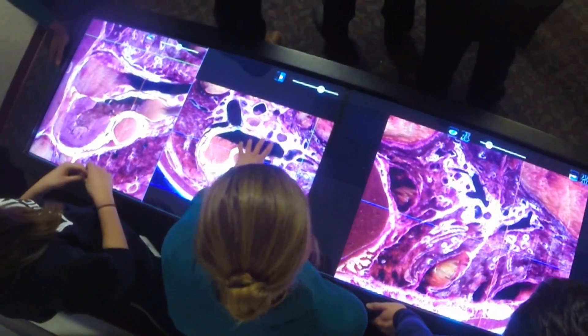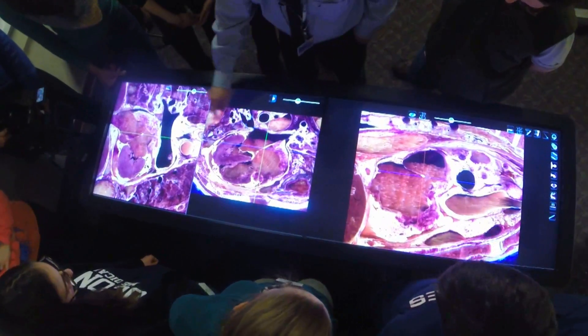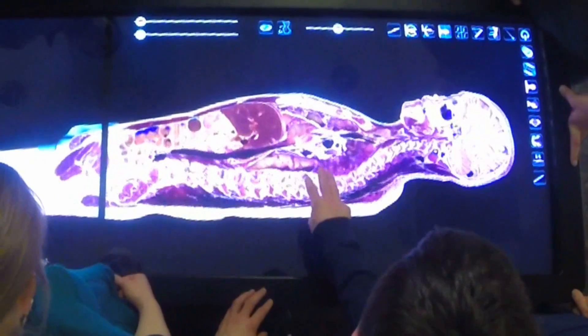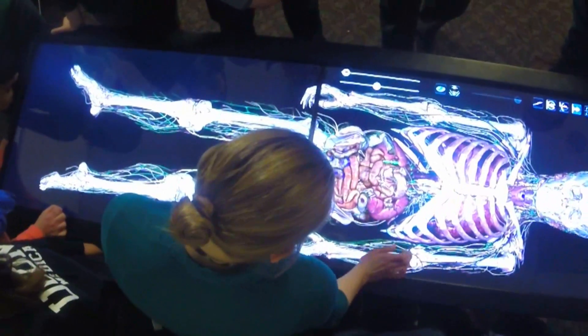That's a terrible spelling. In the lab, you see a cadaver, but a lot of times you haven't dissected it all the way down. So being able to see all different orientations at once is great. Here's your septum, your atrial septum. Translating what they see in the anatomy lab into the cross-sectional views they'll see in radiology — MRI images, CT images — can be challenging. Our hope is that the virtual anatomy table is a great way to bridge the gap between what they see in the gross anatomy lab and what they'll see for the rest of their careers.